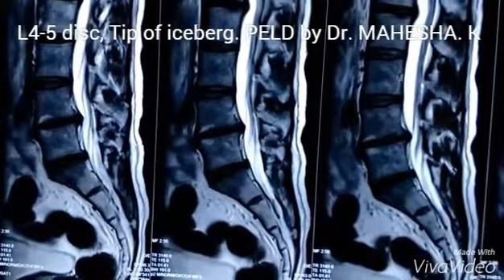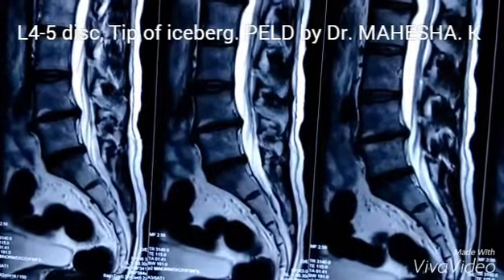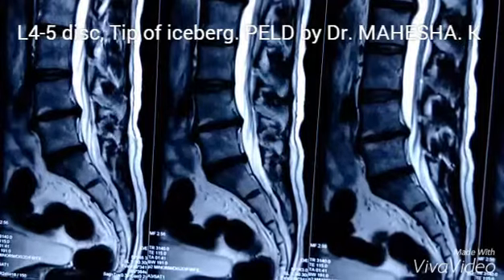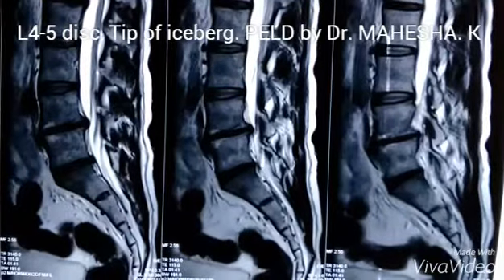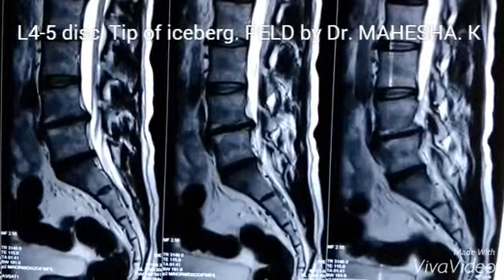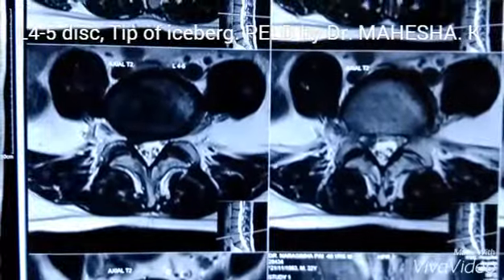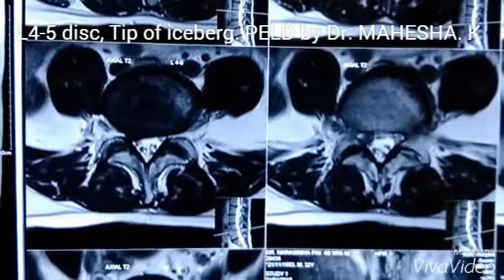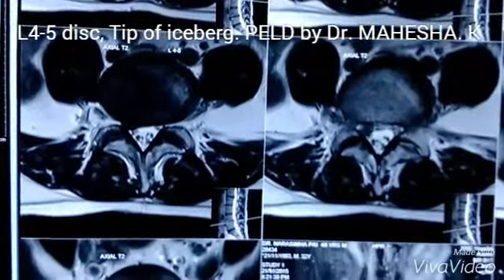Hi, Dr. Mahesh here. Today I am going to show a case of percutaneous endoscopic discectomy L4-L5. This is an MRI scan of a 40-year-old patient who presented with back pain radiating to the right lower limb since 3 months. The MRI scan shows a small disc protrusion on the right side at L4-L5 level.